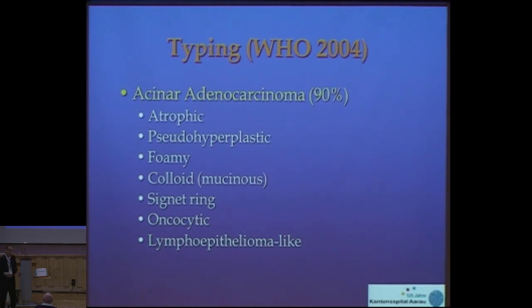So one might say, okay, this guy is sitting at the microscope in his basement looking at fancy pictures and having great fun doing all this stuff. But of course, it is important to recognize this tumor entity in order to give the right diagnosis. Otherwise, if you have a mucinous tumor, one would ask, is that a prostate cancer at all? Or is it a metastasis or anything fancy occurring in the prostate?